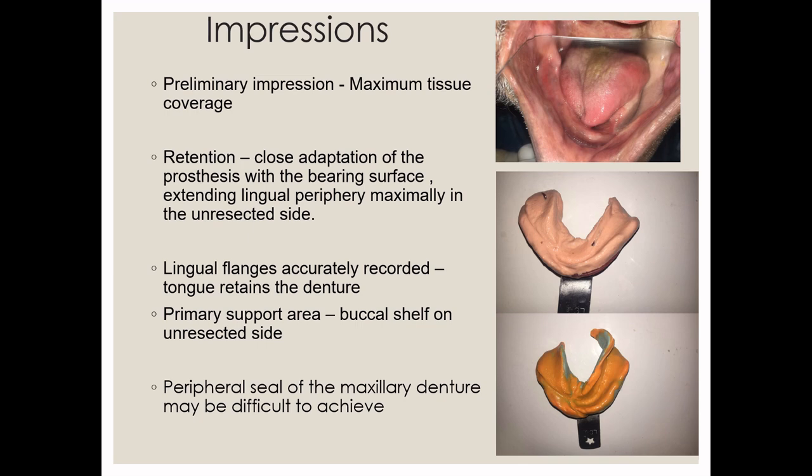And also the mobility and bulk of the tongue is important. If the patient is capable of moving his tongue in a number of directions, then he will be successful in stabilizing the mandibular denture during function. Next is about the support.